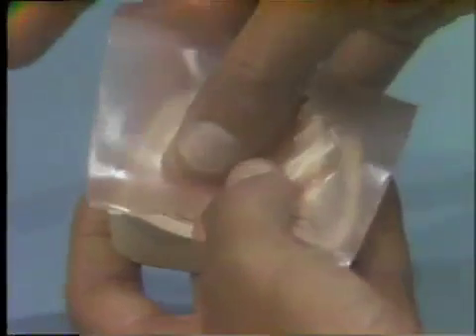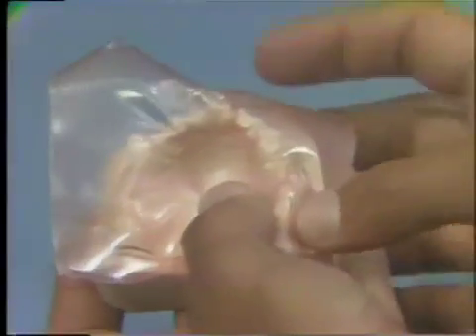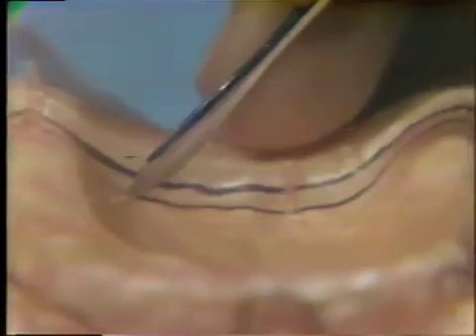Warm one thickness of 28-gauge pink wax and adapt it over the denture base supporting area of the diagnostic cast. The model must be dry for easy adaptation. Minor wrinkles in the wax often cannot be avoided and are considered acceptable. Trim the relief wax to the outline established as the area of relief.